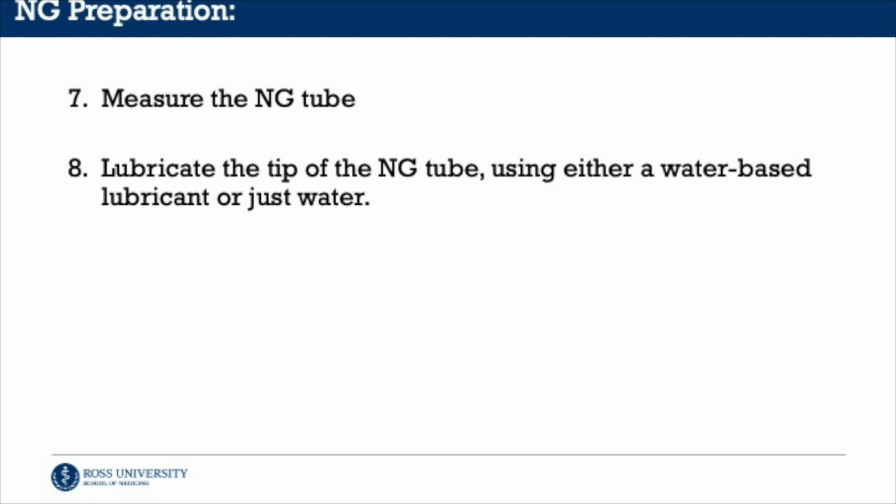Continuing on, we want to measure the NG tube. And lastly, we're going to lubricate the tip of the NG tube using either a water-based lubricant, or you can simply just use water.